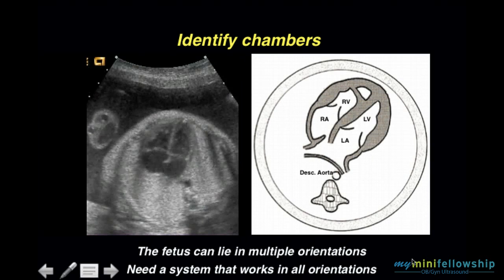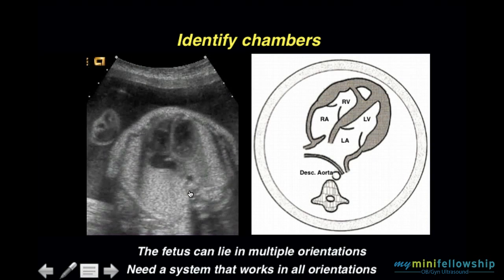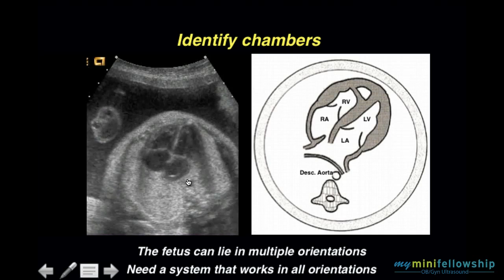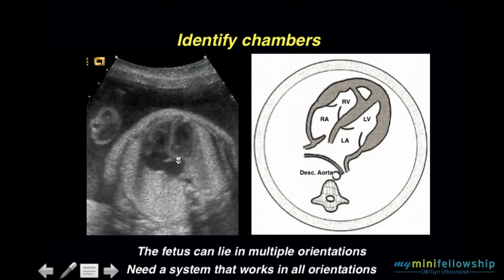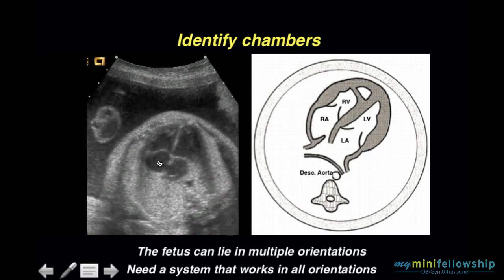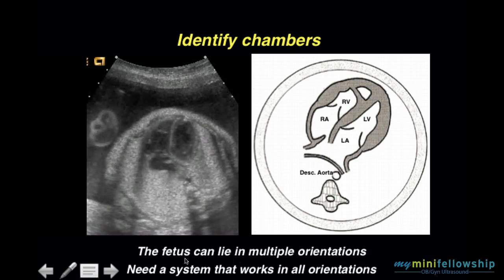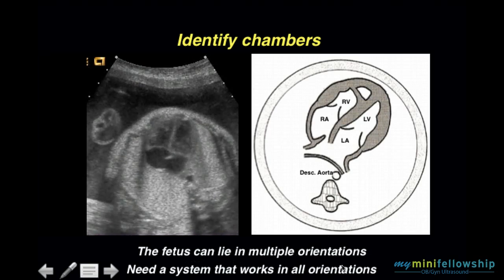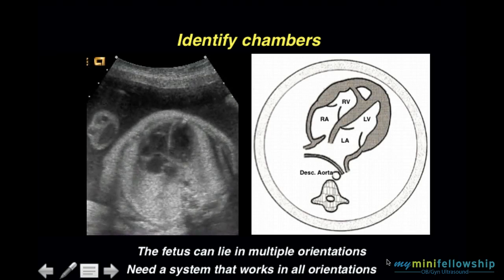Here we have a fetus in a different orientation: spine, descending aorta, left atrium, left ventricle, right ventricle, right atrium. The system works in all orientations.